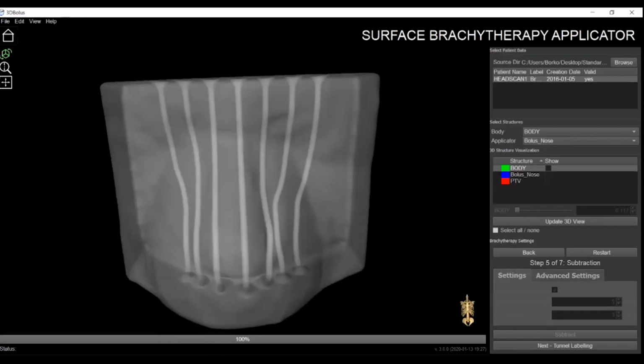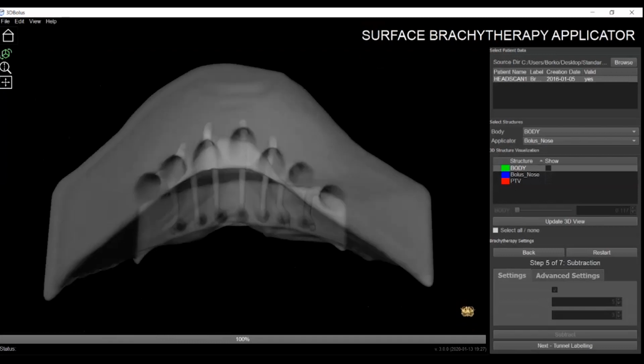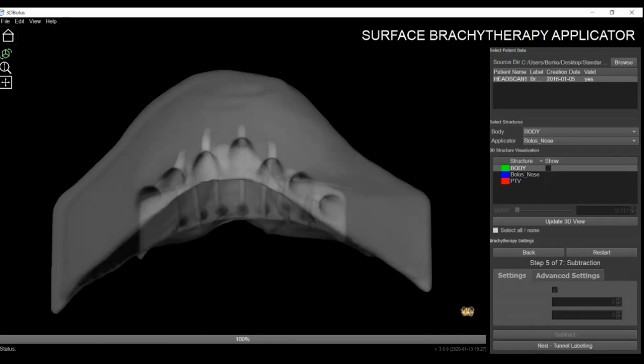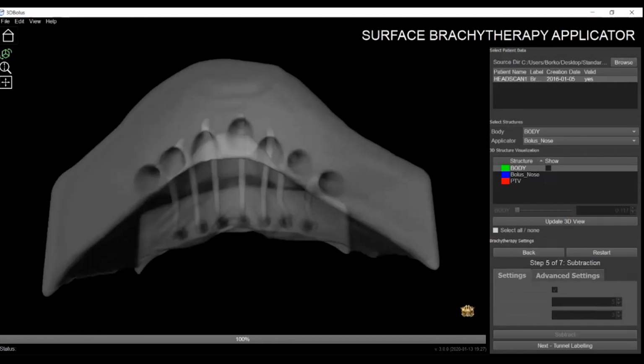We saw that sometimes the bottom part of the print may result in slightly narrower tunnels than expected because of the process of 3D printing, and the bottom part being glued to the printing bed. This issue, of course, came from our experience.